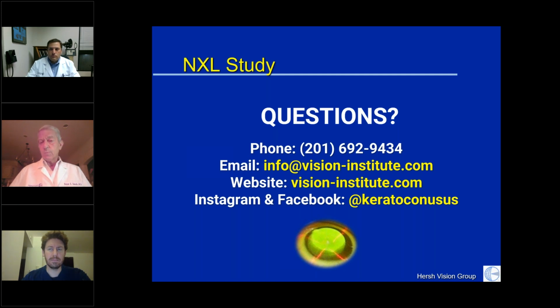This was followed by work that we have been doing in topography guided laser treatments. So there's some select patients who have had crosslinking who can have the cornea smoothed and achieve a better quality of vision and better corneal optics. And there are brand new procedures that we are starting that we've been studying for 6 years in our institute, which we're very excited about, called corneal tissue addition for keratoconus, which is an exciting new method that we hope is going to help a lot of patients.